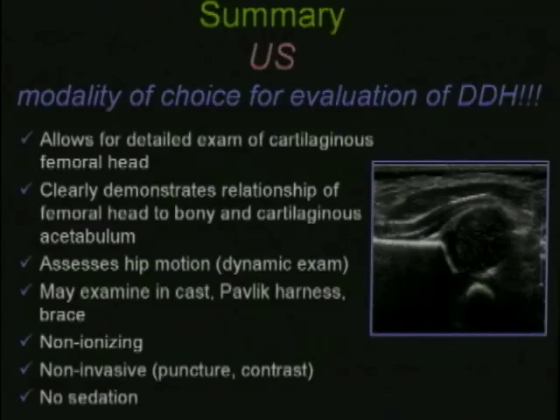So in summary, dynamic hip sonography has become the modality of choice for evaluation of infants suspected of having developmental dysplasia of the infant hip, or those who are at risk for having it. It allows for detailed examination of the cartilaginous femoral head and allows for clear demonstration of the relationship of the head to the bony and the cartilaginous acetabulum. Using the Barlow and the Ortolani maneuvers during the dynamic hip sonogram, we can assess the motion of the hip, and we can examine the babies during treatment.